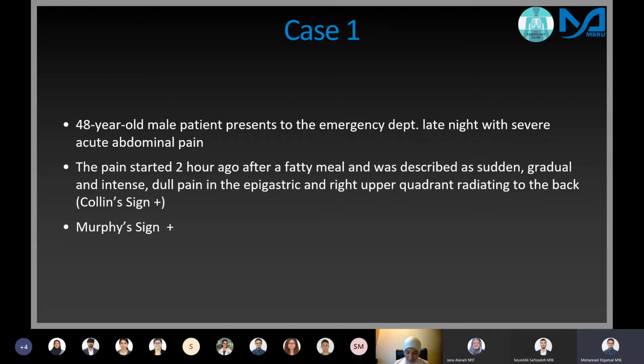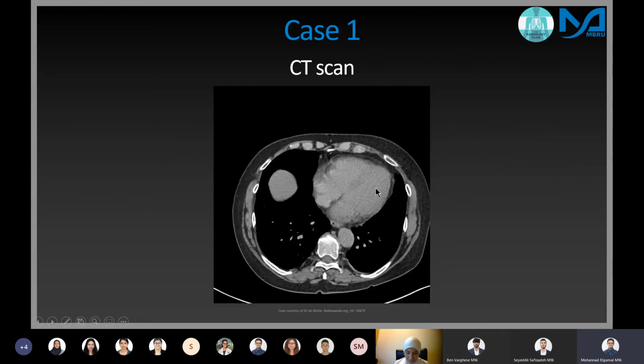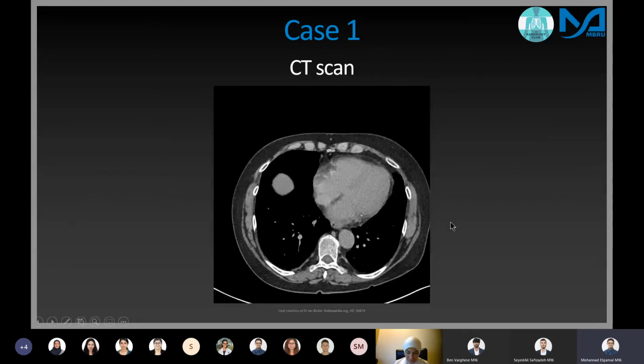But if the patient has a history of kidney failure or any kidney disease, or any problem with his kidneys, or a family history of it, I'd probably do it without contrast, but a CT would be very important. All right, so now let's look at his CT. Also, this is a scrollable image, so you guys can do it.